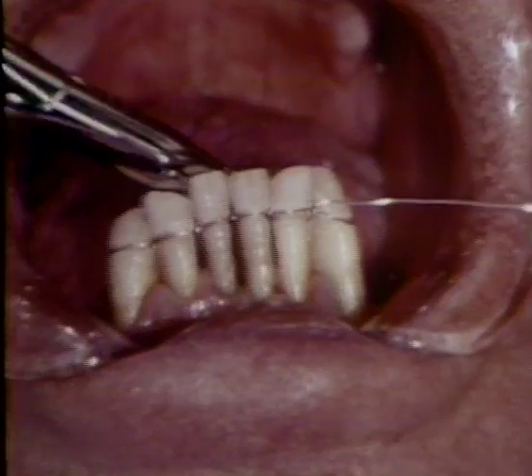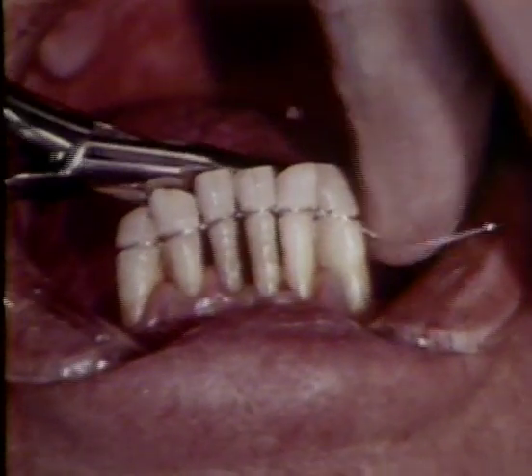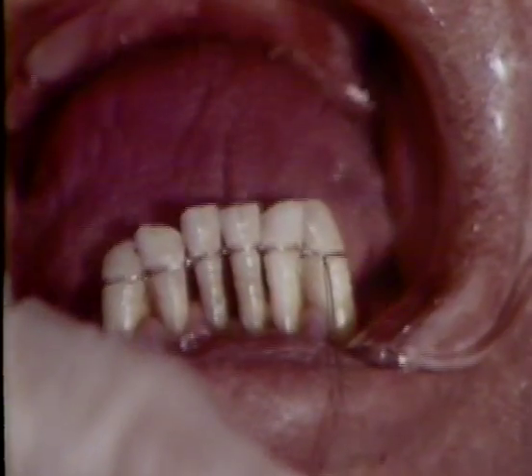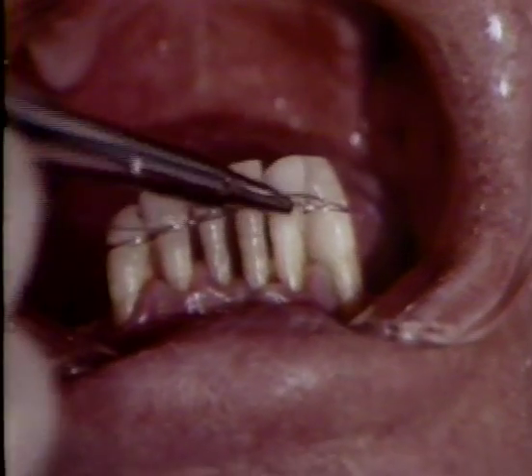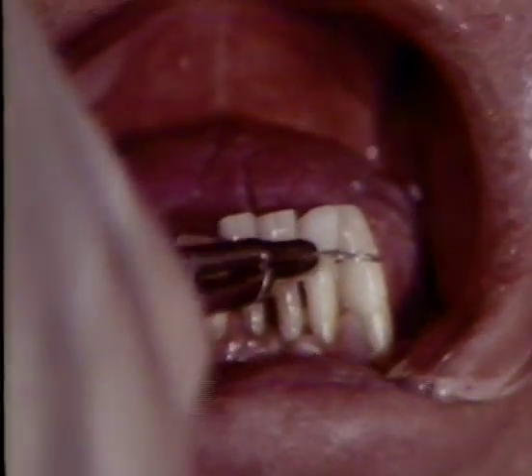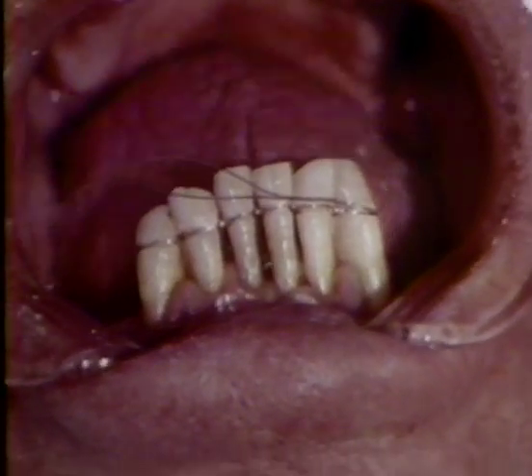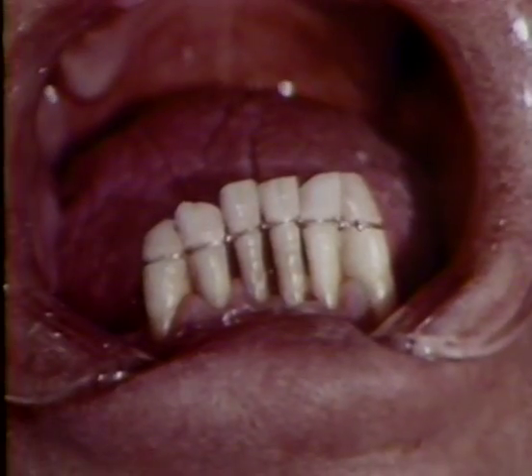After the wire is passed through the embrasure to the lingual aspect of the canine tooth, it is wrapped around the distal surface of the tooth, and the two ends are twisted together. The grooves keep the wire in position. The extra length of wire is cut off and tucked in the interdental space.